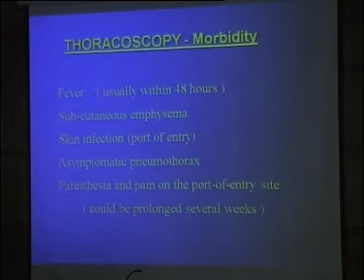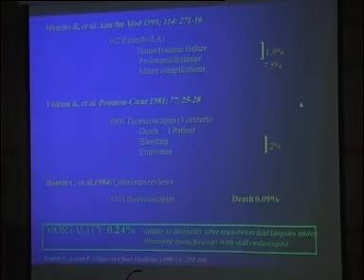And you can get paresthesia and pain at the port of entry site, but I have to say that since we remove the chest tube on the table, there is no more problem at that time. And if you avoid cutting the chest wall during your dissection, I mean cutting the muscular fibers, dissecting like this, always opening your scissors, etc., you avoid this kind of secondary effect, which is a problem for the patient, because it can be painful a long time, and then it's not so good.